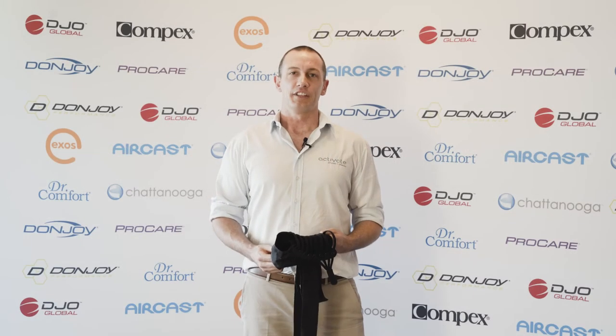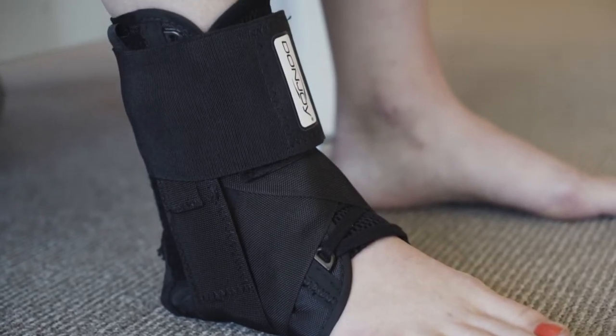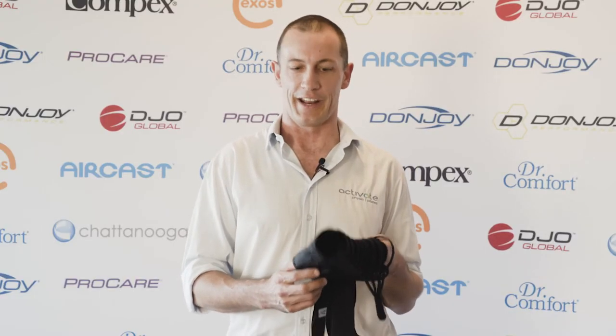Hi, I'm Ben from Activate Physio and today I'm taking a look at the Donjoy Stabilizing Speed Pro Ankle Brace. This is a great adaptation on the lace-up ankle brace which is very quick to get on and off.